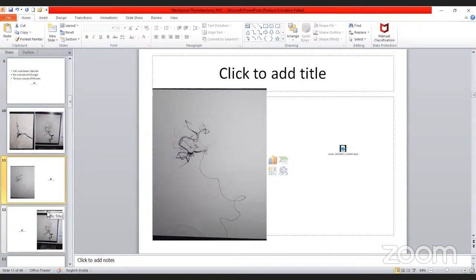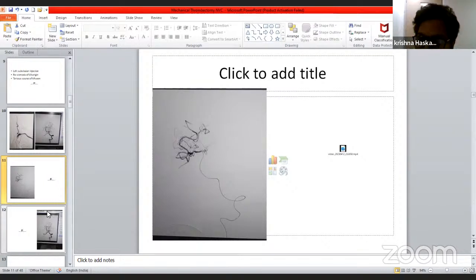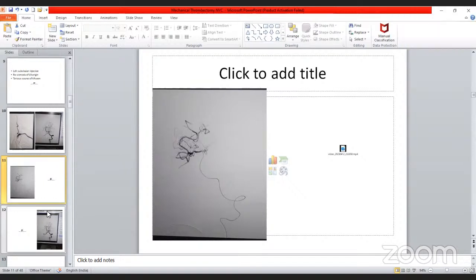Okay, thank you, sir. Any other questions, or shall we wind up? Is the guidewire used the same with the 10 microcatheter? Yeah, it is the same. Yes, sir.